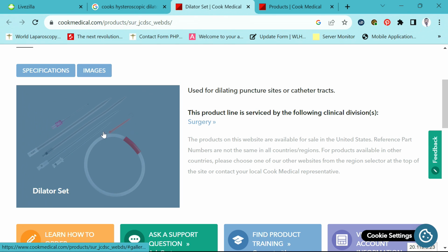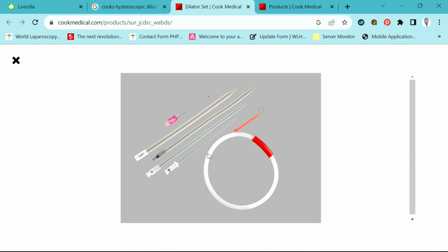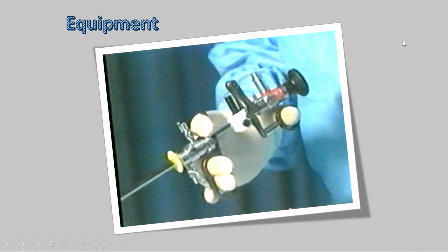And you will introduce it and then you will dilate it. So this is for hysteroscopy, you can use it. But the problem is that you need the 4 channel, then only you can use it. Now, biopsy also you can take with the biopsy forceps with the 4 channel, but you cannot do any resection.